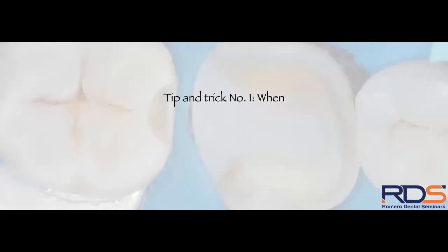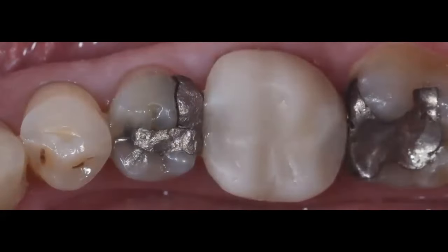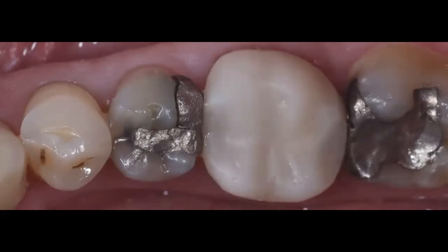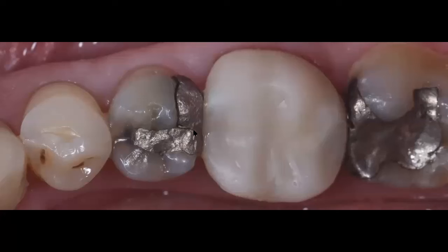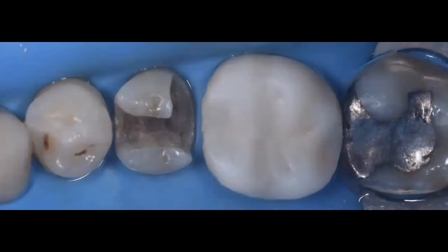The first tip and trick: when do we elevate a margin? My presentations are very clinical — my goal is to share information you can apply tomorrow in your practice. This patient presented with hypersensitivity on tooth number 29. You can see the large amalgam with an open margin on the buccal aspect and a fractured amalgam right at the marginal ridge, which explains the sensitivity.